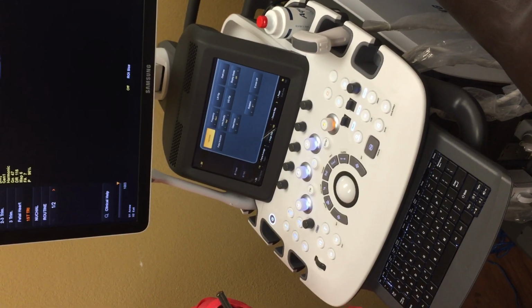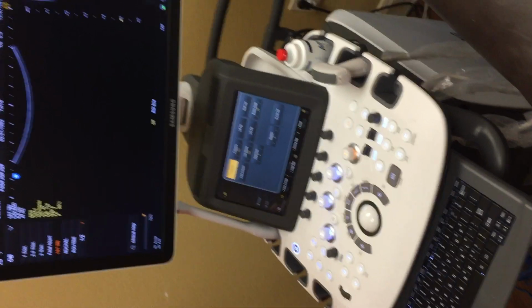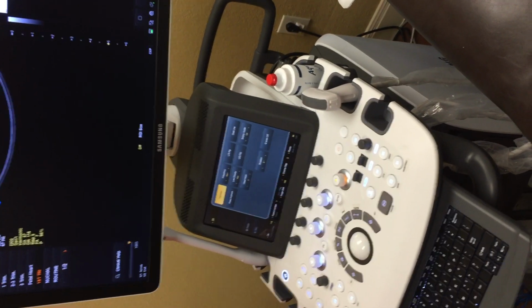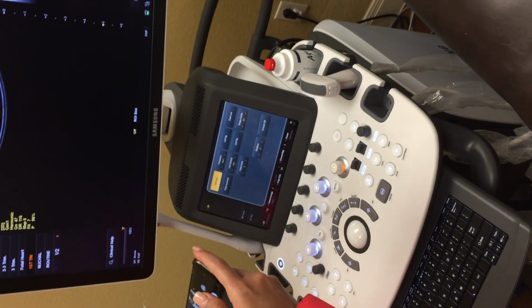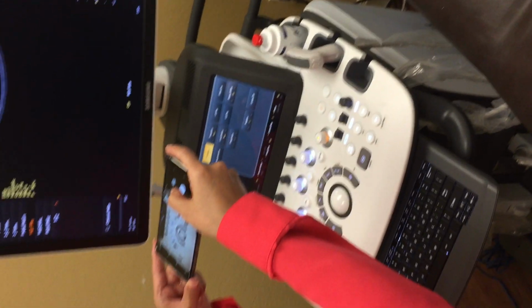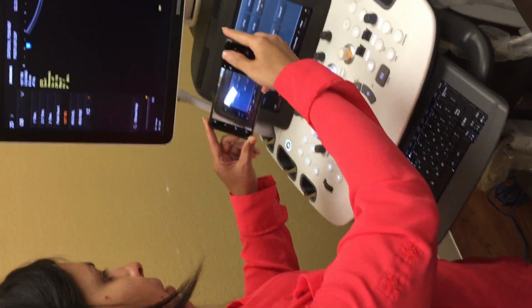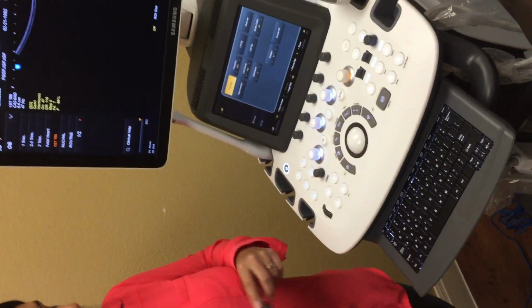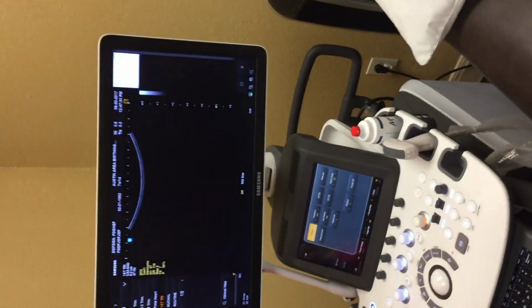It seems somewhat intuitive. She told me that. And it's also kind of similar to the previous machine. There are some similarities, but I think it's also noticeable. I really like this machine. Way fewer buttons. Yeah, I appreciate that. A lot less effort. Apparently you knew how to use about 3 of those buttons.